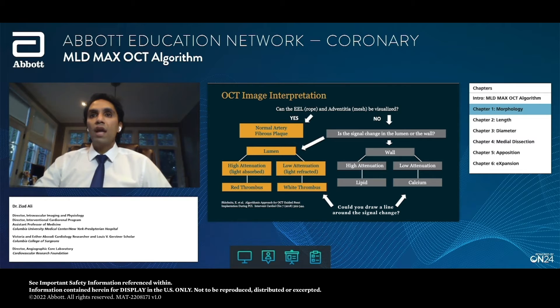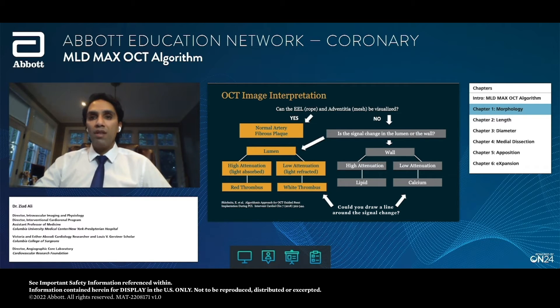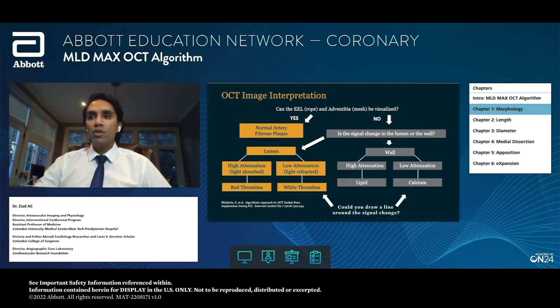On the contrary, when there are segments of the cross-section where you can't see the rope or the mesh, there's a signal change in the lumen or in the wall. When it's in the lumen and it's high attenuation — meaning the light is absorbed — this is red thrombus. When it's low attenuation, meaning the light hits something and is refracted, it's white thrombus. When that signal change occurs in the wall and it's high attenuation, it's lipid. When it's low attenuation and the light is being refracted, it's calcium.